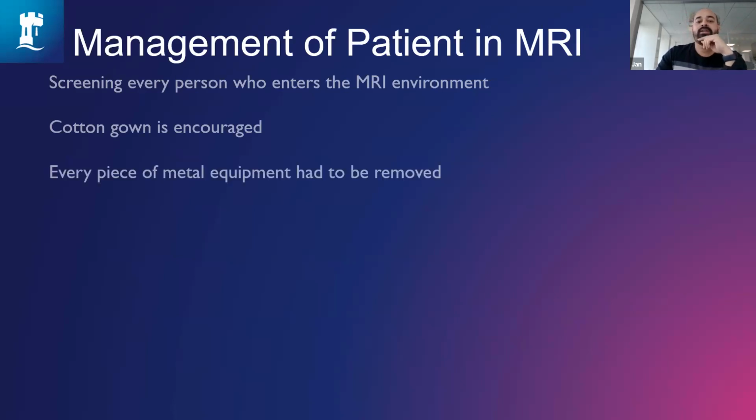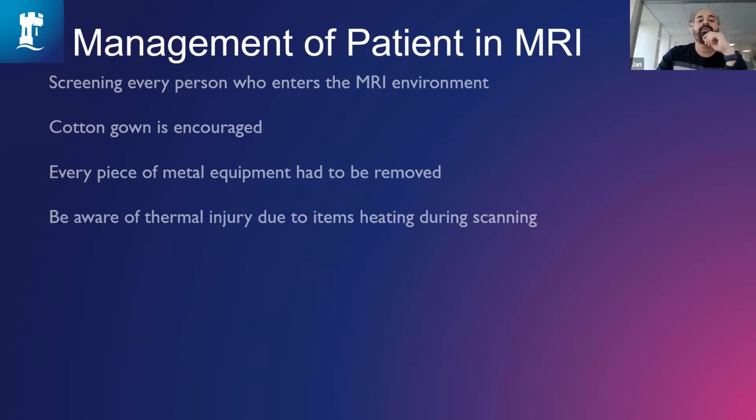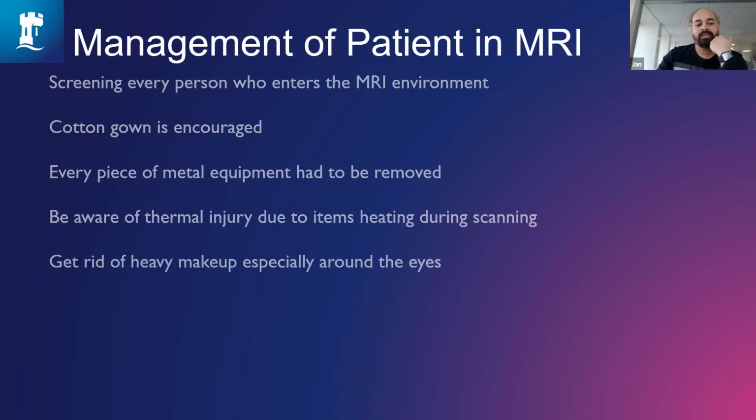Every piece of metal equipment has to be removed. Yeah, that's a given. Be aware of thermal injury due to items heating during scanning. So as I did mention, if you have any peripheral equipment being attached, make sure that you pad it off and do not let it touch the skin of the patient. Get rid of heavy makeup, especially around the eyes. Some people turn up with heavy makeup on the eyes, and it's always advisable for them to take it off if you're doing a scan of the head or anything.